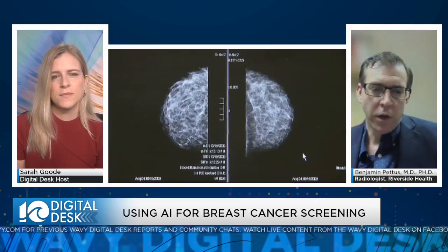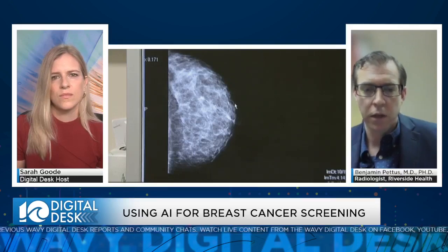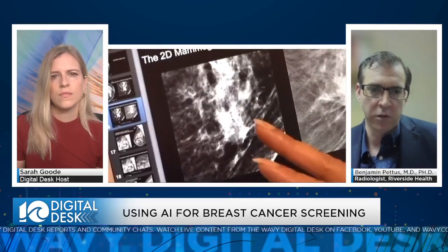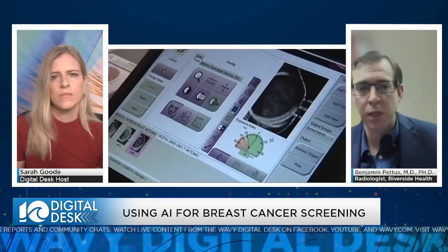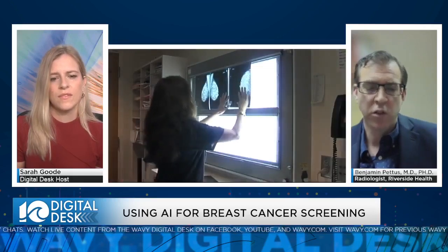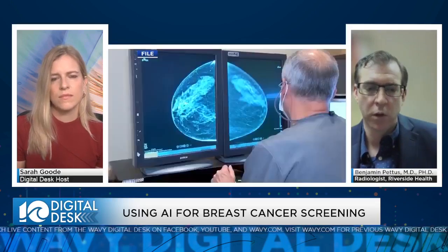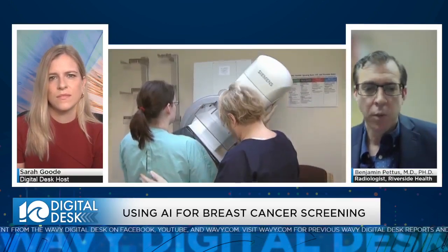So, yeah, I don't know if it's necessarily solving that need, but theoretically, AI, because it's focused on the morphology or shape, it's less dependent on the size of the image, and so it could find things theoretically smaller than we might even. So it may be that the combination is going to be better, but again, certainly it can't see a change yet, and they're working on that, a change in tissue density from time to time. There's a lot of benign types of lesions where the shape is okay, but if it was new, that would be suspect. So, again, it's just an attempt to harmonize and work better, but mammography is not a perfect test.